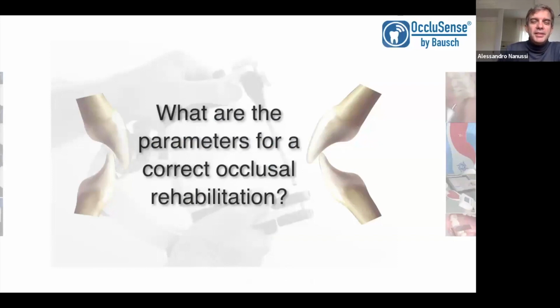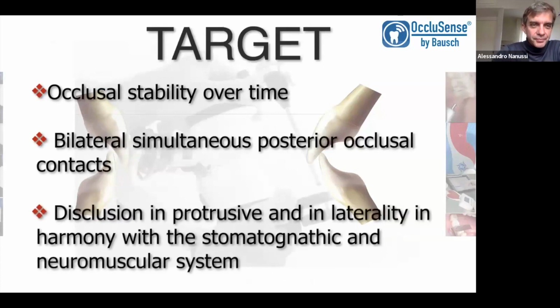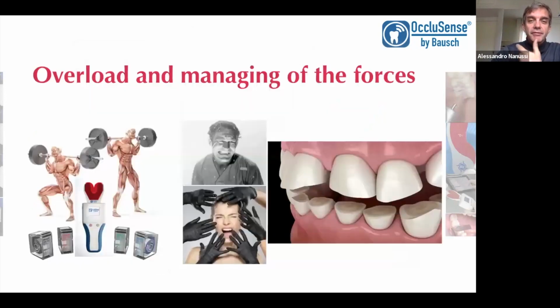Today we speak about the parameters of a correct occlusal rehabilitation and how to manage overload, because usually we need to respect the function by checking the occlusal stability over time. Bilateral simultaneous posterior occlusal contact is important, and the disclusion in protrusive and lateral movements has to be in harmony with stomatognathic system function, with the neuromuscular function, and with the activity of the temporomandibular joint. But what is the limit for the movement? The teeth, and we need to check the forces on the teeth. We need to be worried about overload, and we have to manage it.